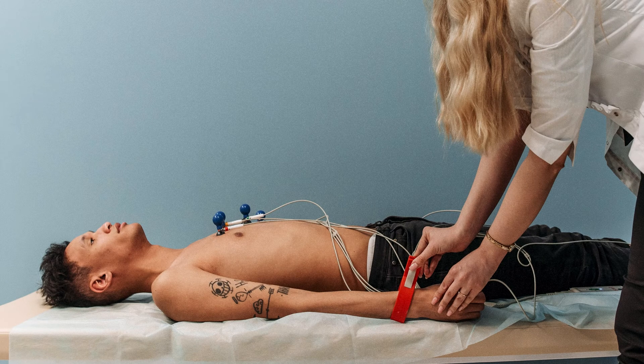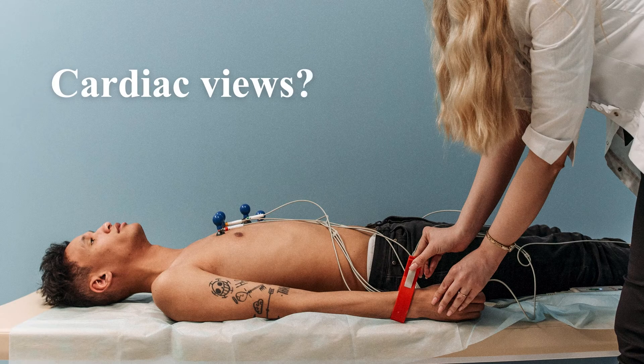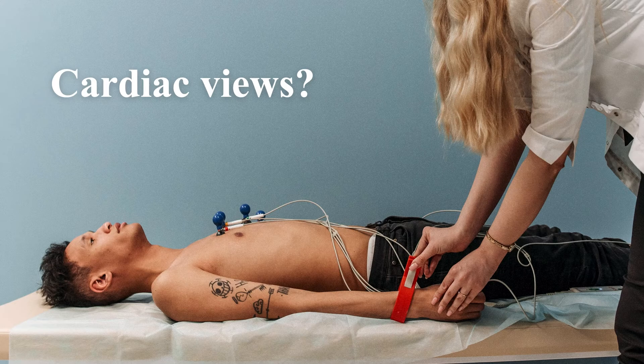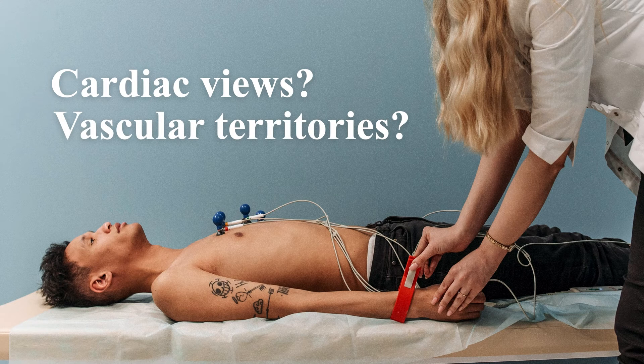In this video, we will review why on a 12-lead ECG, certain leads are associated with certain cardiac views, and in turn, the vascular territories.